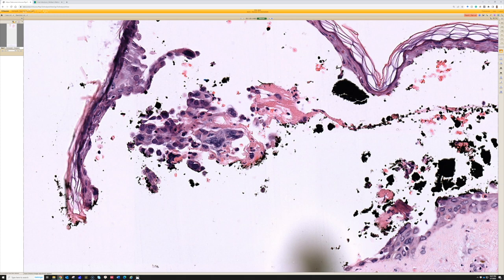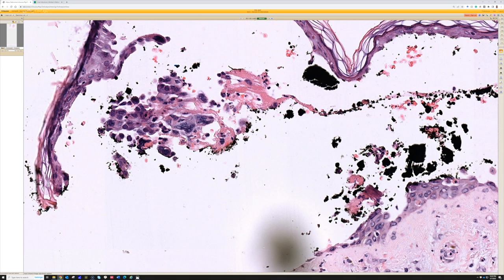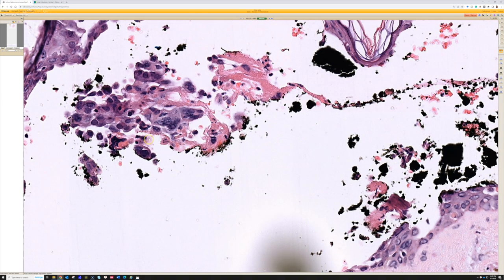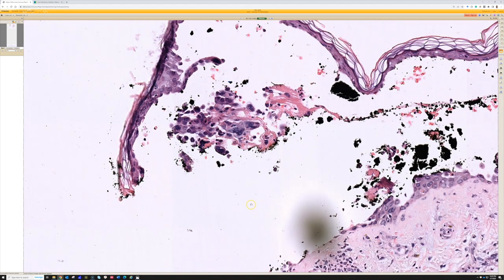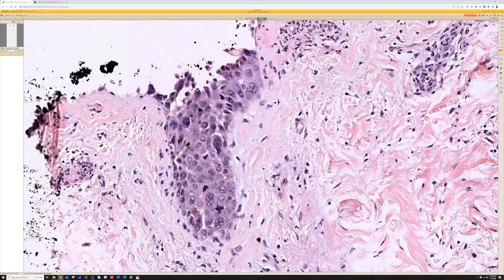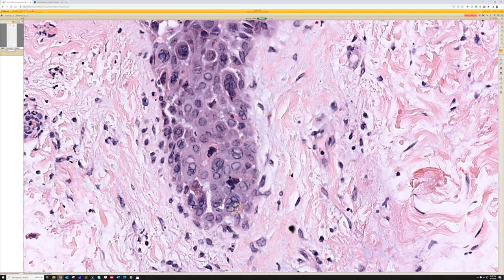There are some immunobullous diseases like pemphigus that can have acantholysis and blistering, but this is not immunobullous — this is actually a viral disease. We're going to be talking about viral diseases today and a few mimics. We have detached acantholytic keratinocytes that are rounded up and some necrotic material. Looking closer into a hair follicle opening, we can see the classic cytologic features: multinucleation, molding of nuclei together, and margination of chromatin — the 3 M's of herpes — seen in both HSV and varicella zoster. This is VZV, and the only way to definitively know that is by doing an immunostain or PCR.